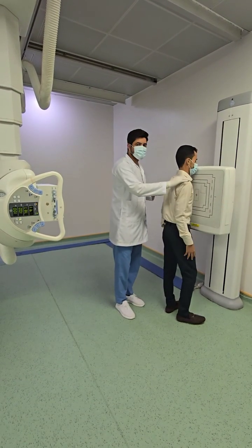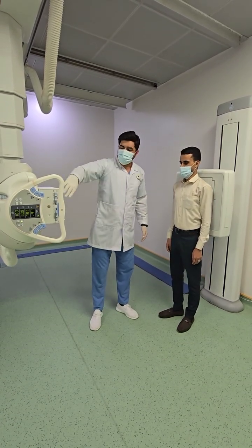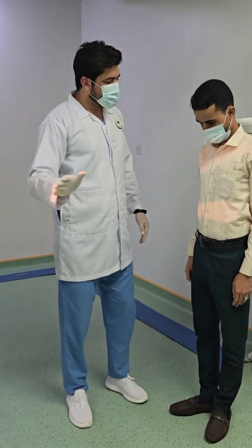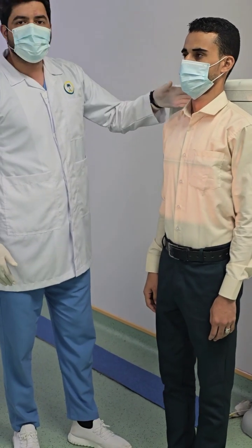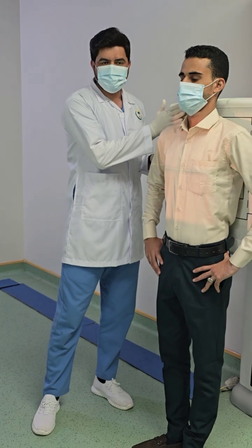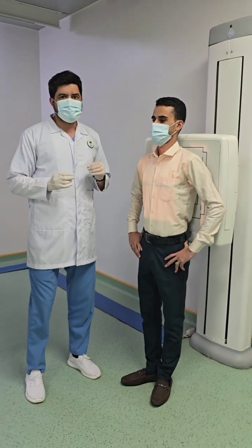Now I will show you the anterior posterior position. This is the anterior aspect of the body. I will open the light. The X-ray will come out of the X-ray tube, interact at the anterior aspect of the body, then get inside the body and emerge from the posterior aspect of the body and finally interact with the cassette or the detector. This is AP. Another one is the lateral.